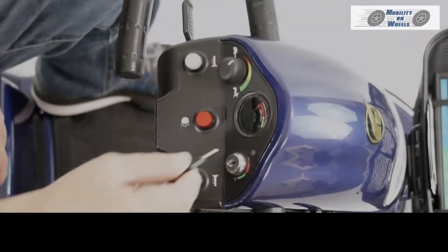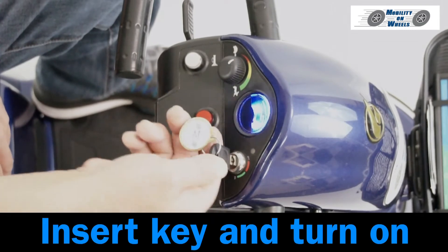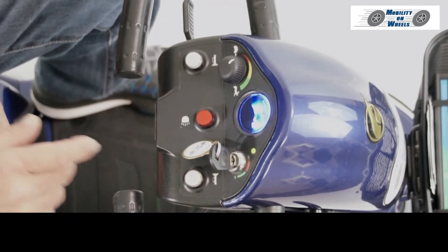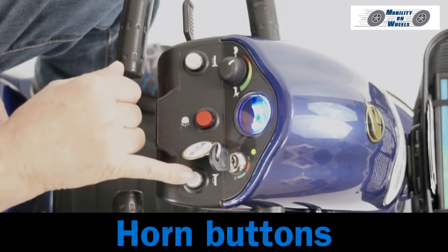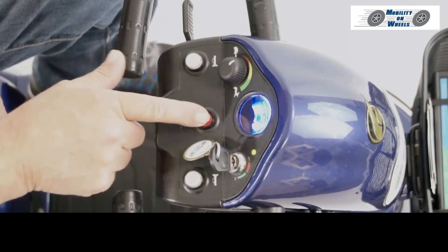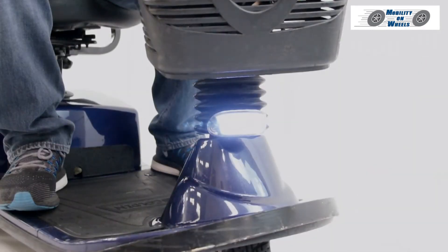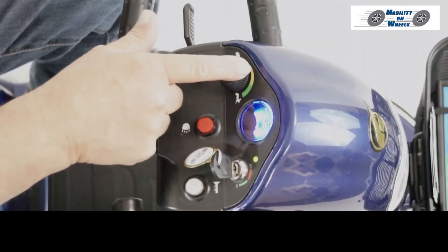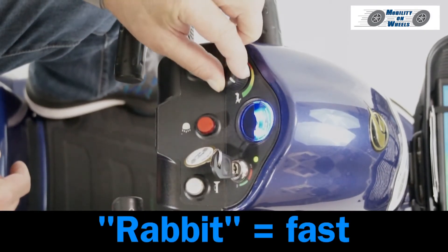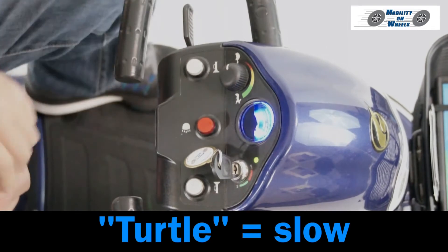Operating the controls. Insert the key and turn on. The battery gauge shows charge level. Horn buttons are available, as well as a head and tail light button. The speed dial controls your speed: Rabbit equals fast, Turtle equals slow.